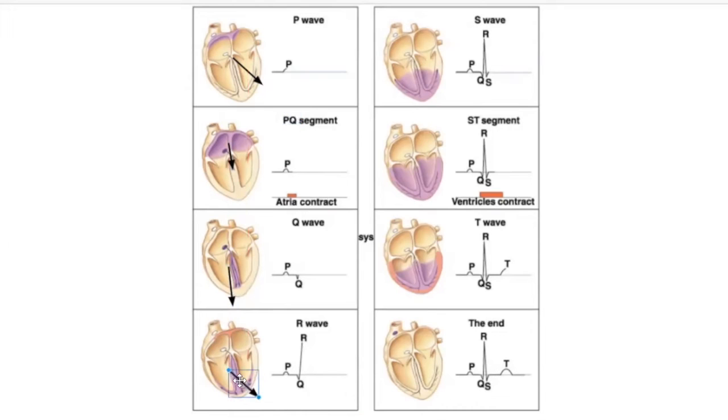This one's a little complicated. The septum's already, for the most part, pretty activated, so now we're activating up and around the sides of the ventricles. We have to think about this idea of superposition. We've got a bunch of different vectors, but when they all add together, what's their overall direction? In this case, it looks like more of them are pointing a little bit towards the left.